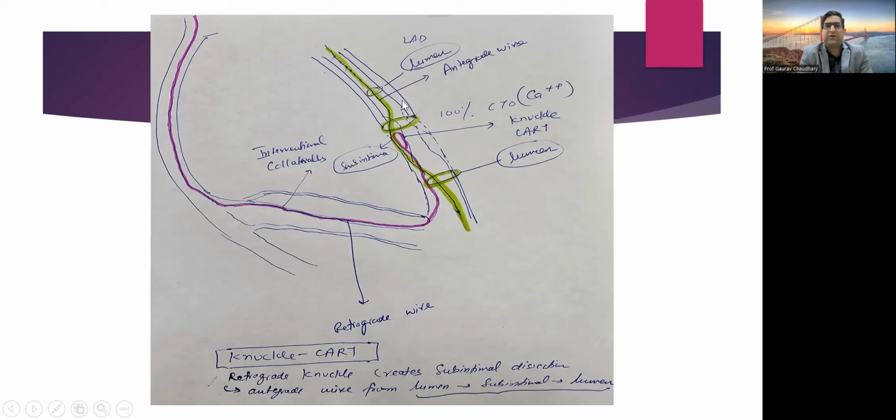If it is not going into the true lumen, then we can make a knuckle, a jug-handle-like appearance, of the hydrophilic polymer jacketed wires like Fielder XTR. Sometimes we can of course use wires like Gaia 2, and we can also use the Gladius MG or Gladius Mongo.